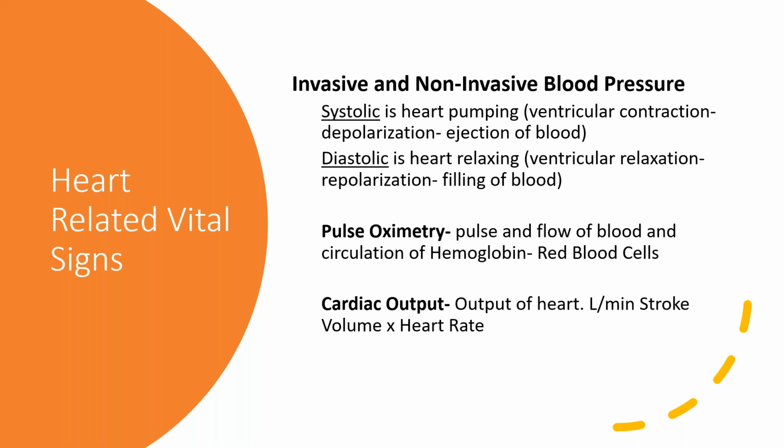So when I started working in an adult hospital and I do that cardiothoracic surgery ICU, which is all the patients that have had open heart surgery recovering, we have continuous cardiac output. And I thought, man, this is really cool. How does it work? What are they doing? I'm not going to get into all that in this presentation, it's beyond the scope, but it's a neat way to do cardiac output. And a lot of time in ICUs, cardiac ICUs, cardiac output is a big deal.